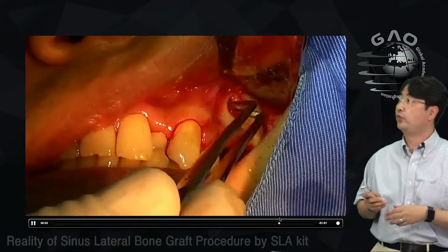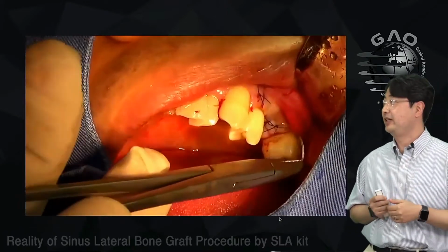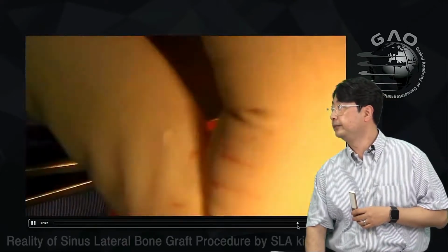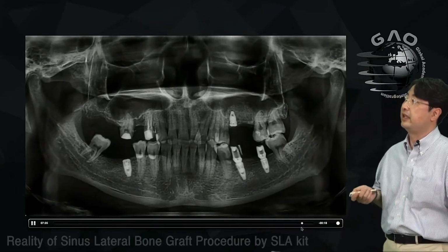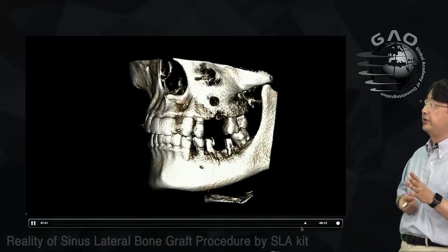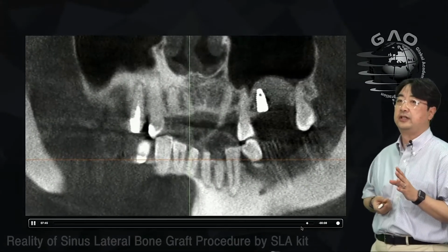Then I cover the window with the PRF membrane. It doesn't have to be done, and then I close the wound like this. So this is immediately after the sinus graft, and you see the window opening on the anterior lateral wall, and this is a CT cut of the surgery.